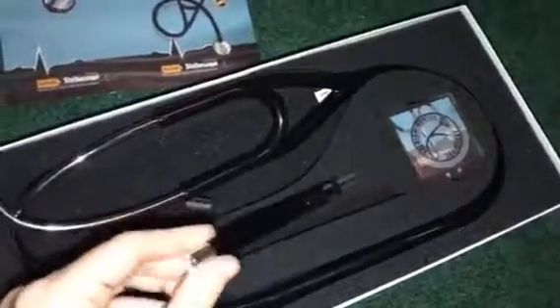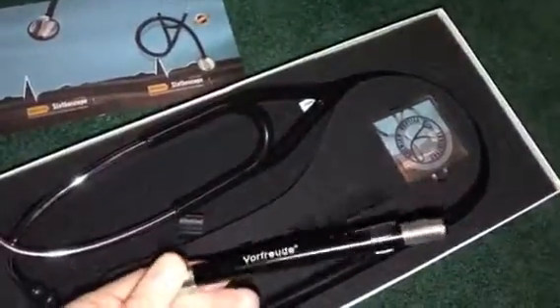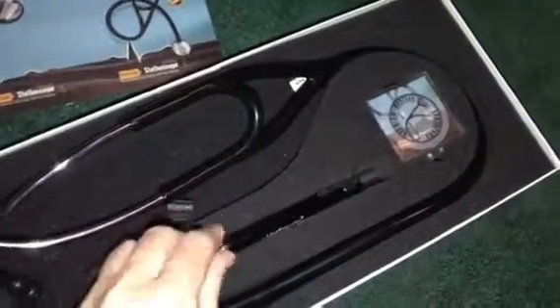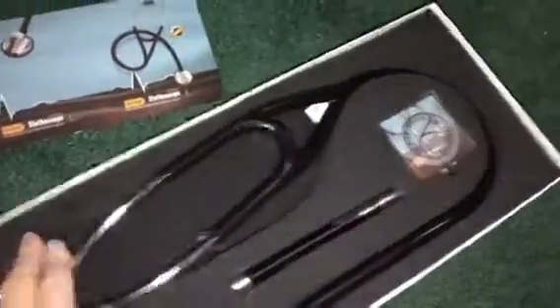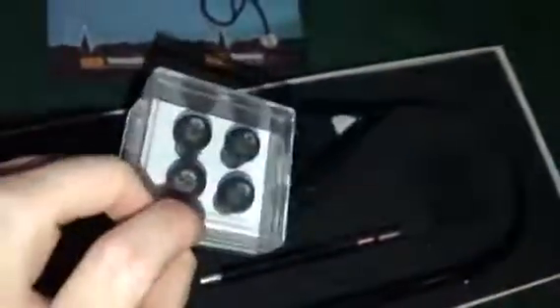It also comes with an extra gift — a flashlight. It doesn't have batteries in it right now, otherwise I would turn it on. And in here it just has extra earbuds for the stethoscope.